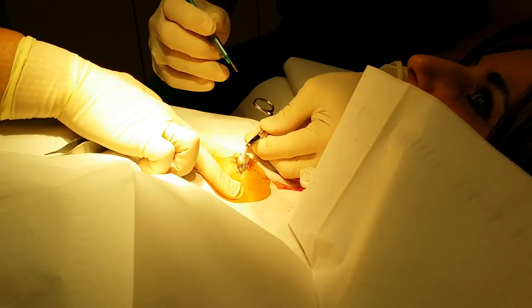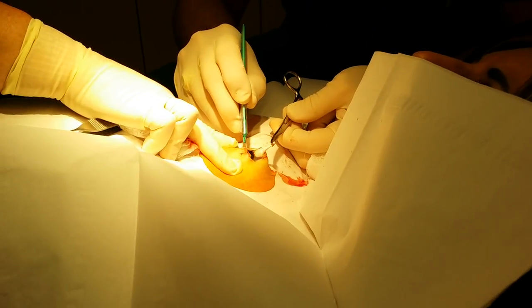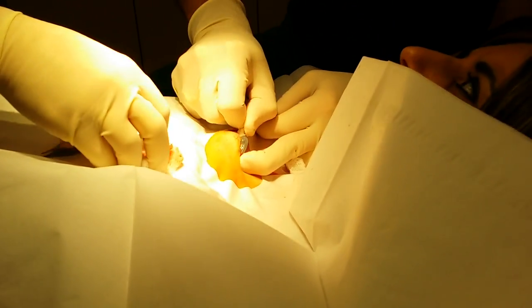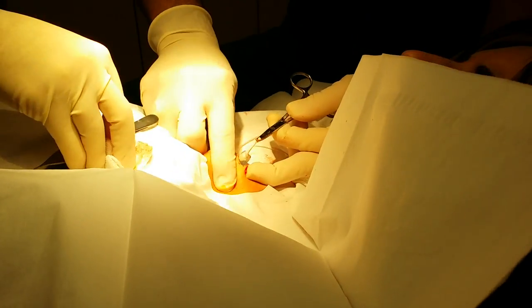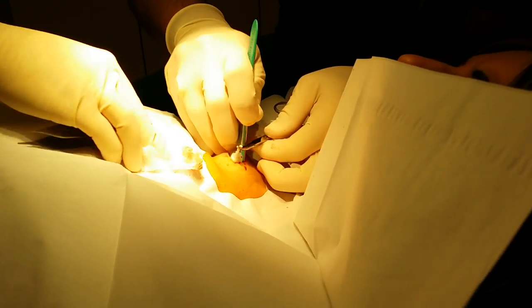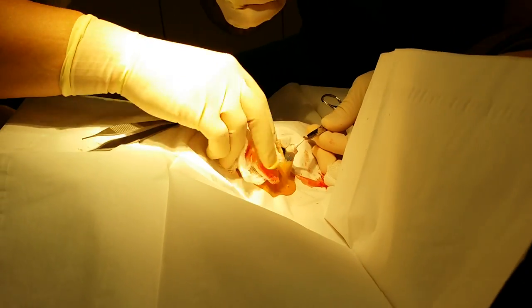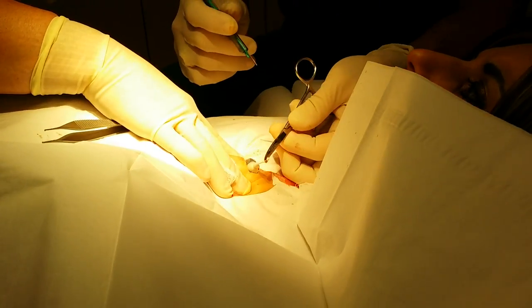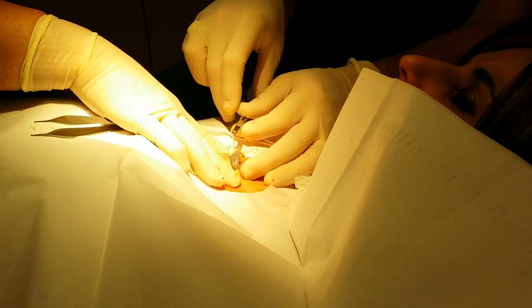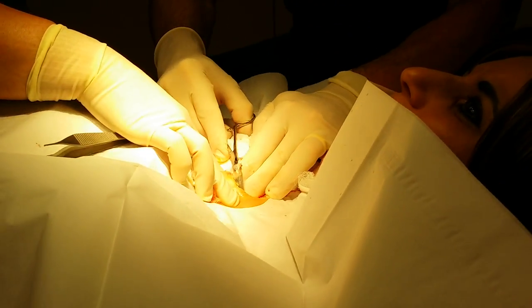Now I have a firm grip on exactly what I want to get out. I'm just freeing it up on either side a little bit. Now I can feel you pulling on me. I think there might be one more attachment down there — did they attach it to the skin? Yes, sometimes they put a suture to hold it in place. Something's holding it up — just a little pressure, sorry.